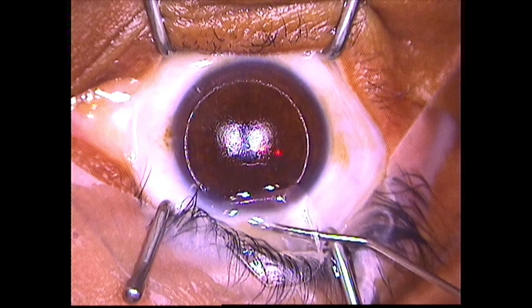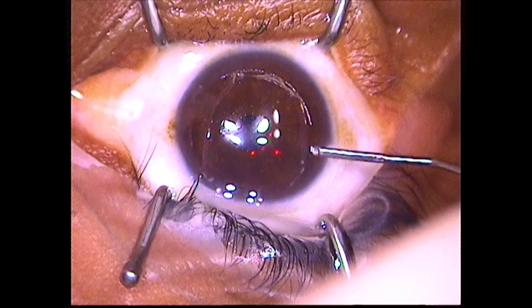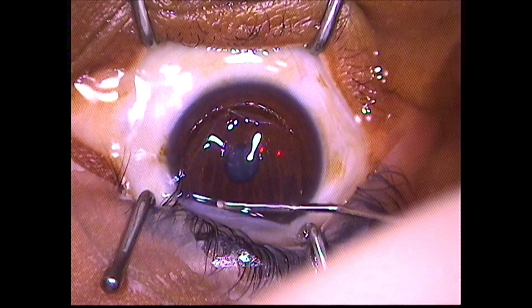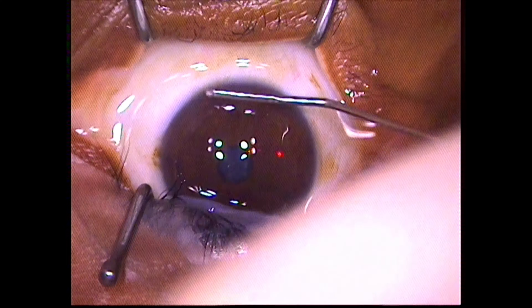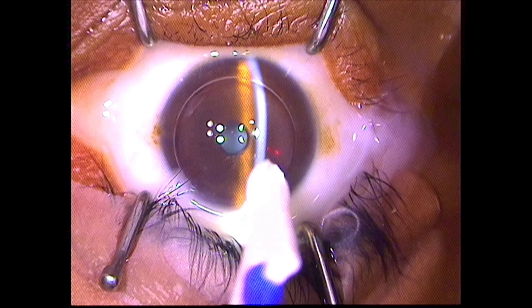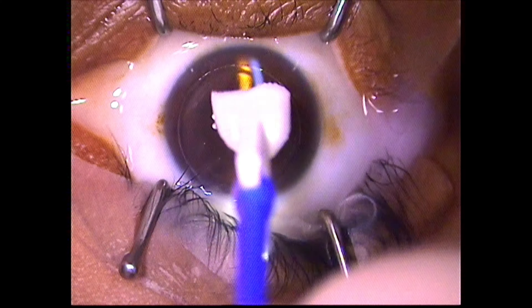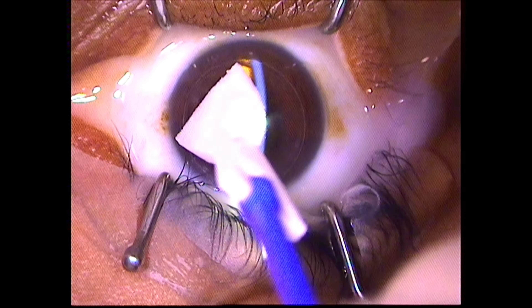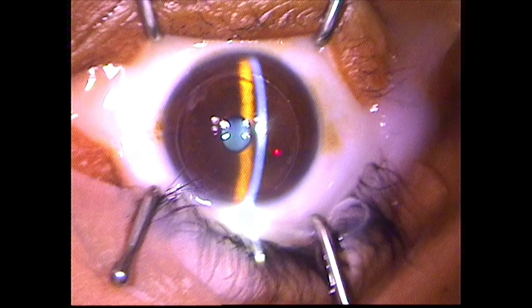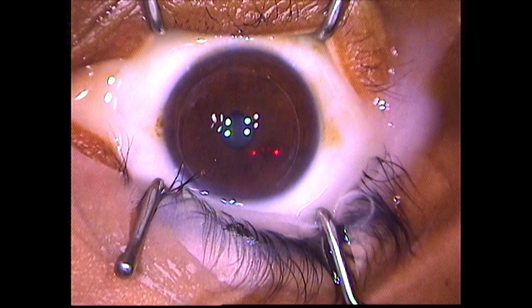Once the laser is done, saline is used to float the flap back down. A surgical sponge is used to ensure the edges are aligned perfectly. Steroid and antibiotic drops are given. And that's it.